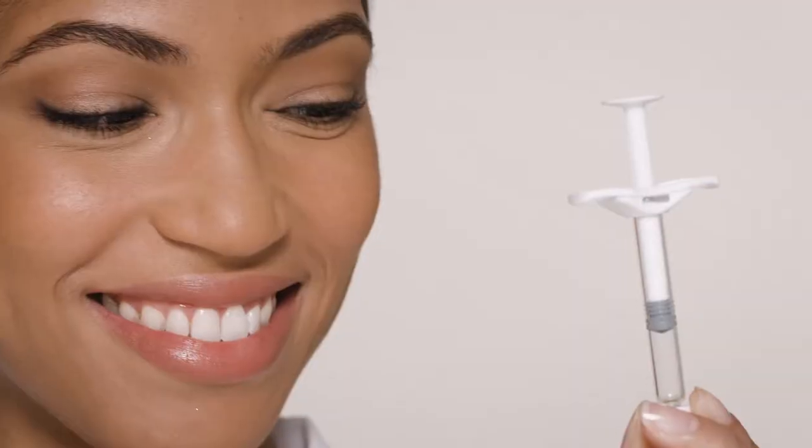Should we show everyone how to put this syringe together? One thing before we start: it's important to hold the luer lock adapter and syringe firmly throughout the assembly process for proper needle attachment.